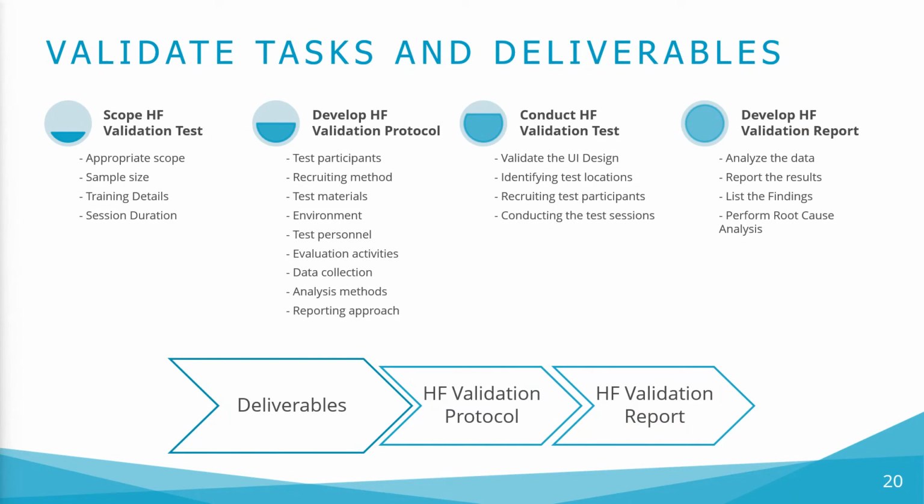After successful completion of the validate step, update the following in the HFE report: analysis of hazards and risk associated with device use, description and categorization of critical tasks, and details of HF validation testing.